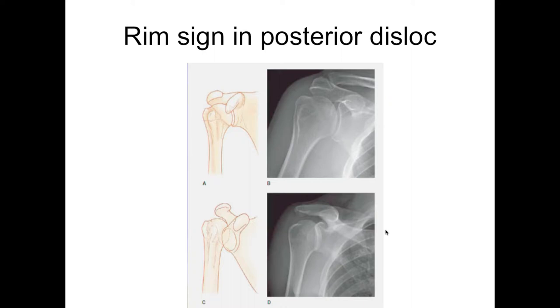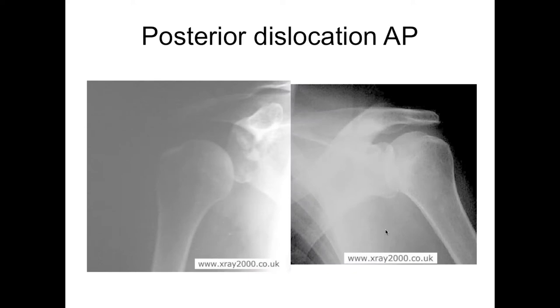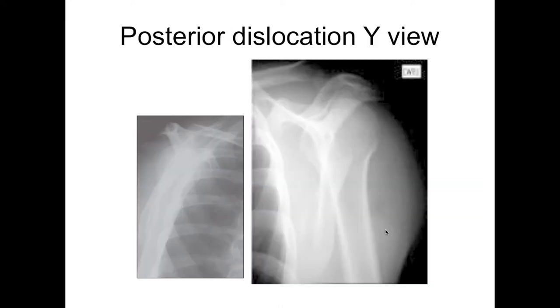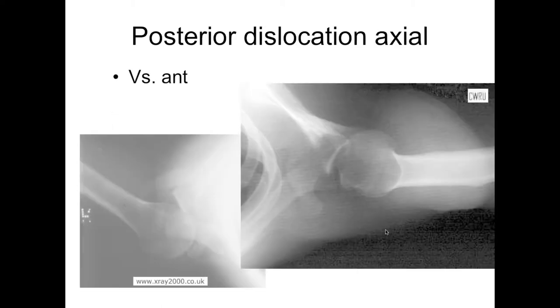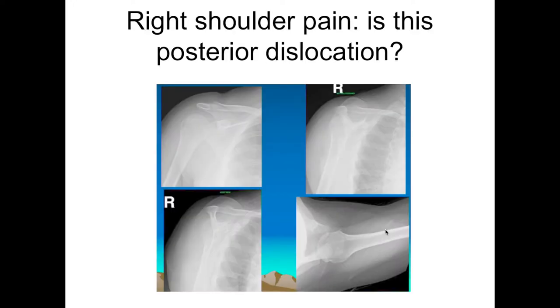You can also get the rim sign, where there's overlap — the humeral head's behind the glenoid, so there's going to be overlap. A bunch of subtle findings. On the AP view there's some overlap. On the Y view, it looks like the humeral head is going towards the acromion rather than the coracoid — once again, it looks posterior. On the Y view you can see it's not where it's supposed to be and not where your typical anterior dislocation is. Getting an axillary view can clear things up — on the bottom right you can see it's clearly within the glenoid fossa, clearing up any question about dislocation.